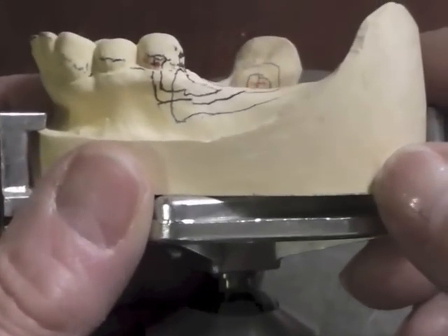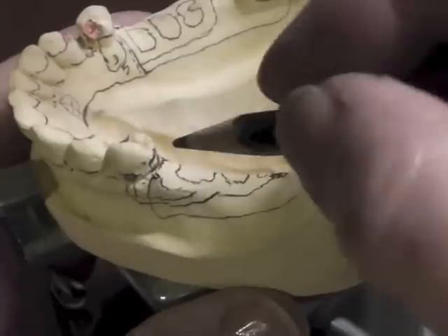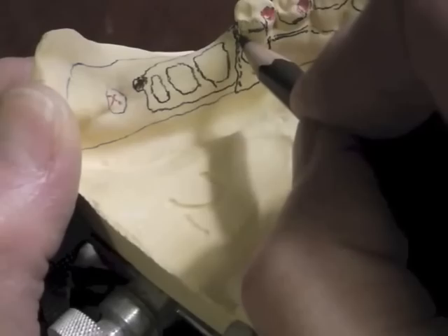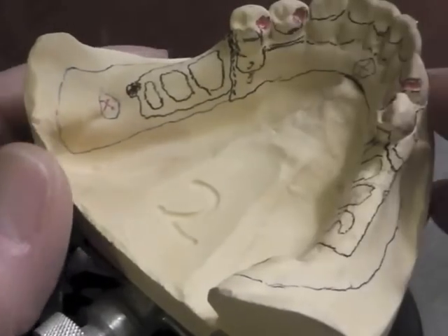This is the RPI system: mesial rest, distal guide plate, eye bar, tip on the lingual. The reciprocal component is a combination of this minor connector and the guide plate keeping that tooth from moving to the lingual.